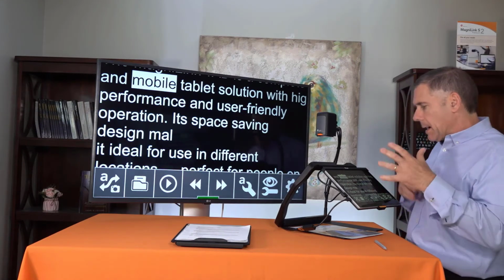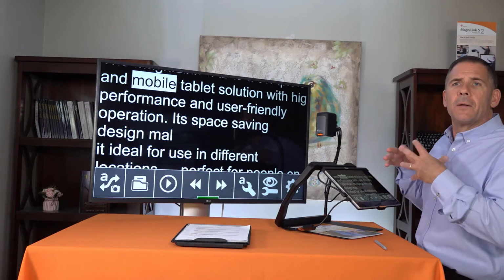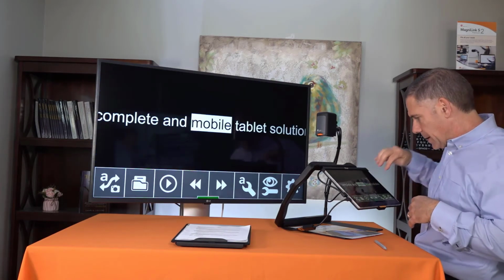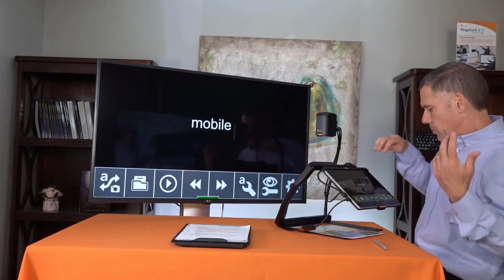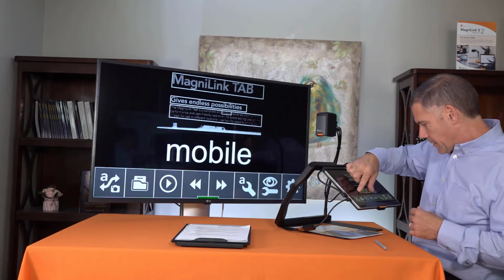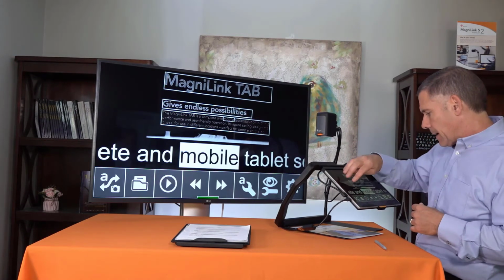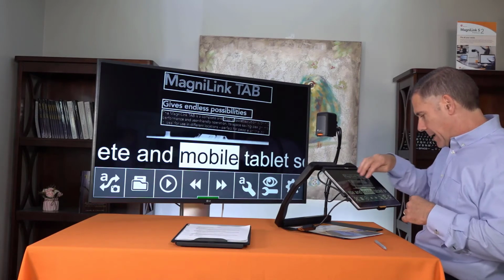But anyway, I now take 4 fingers. Say this is my most desired way to read when it scans. But say I don't want that. I want to do a sentence. I want to do a word. I want the document. I want to put a word under the document. I want to go... Speaking speed 200. I want to go even bigger. I mean, I want to add a sentence. Now I'm back. Speed 200.